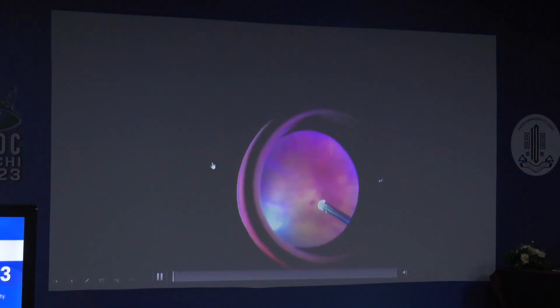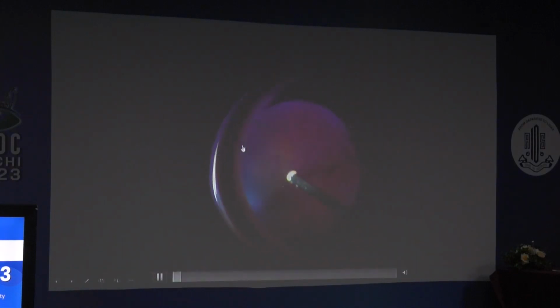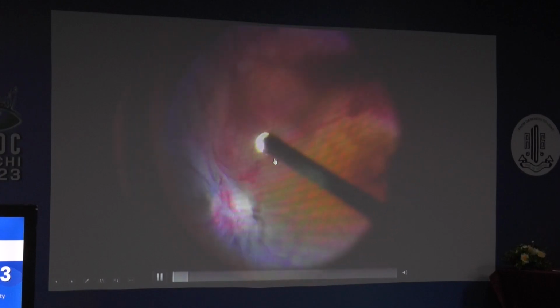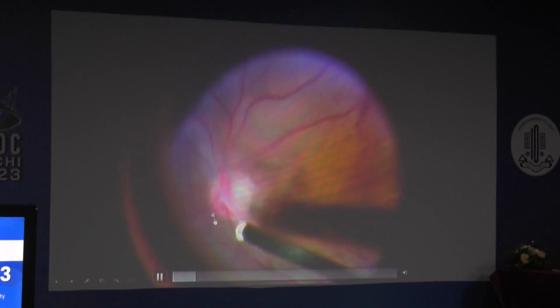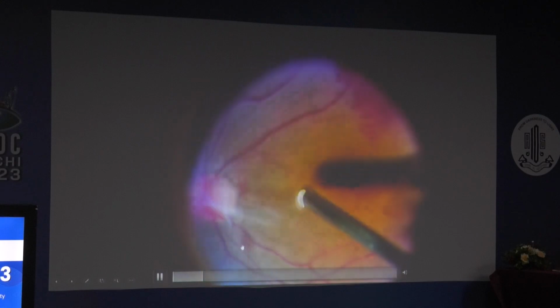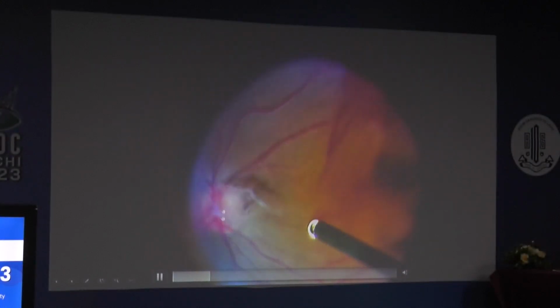This is a patient who has had vitreous hemorrhage. So you do a core vitrectomy initially, and gradually, if the retina starts becoming visible, identify the culprit. Culprit means from where the blood is. Here you see there's a massive frond off the disc. So you truncate this, and then sometimes this may bleed, sometimes it may not.